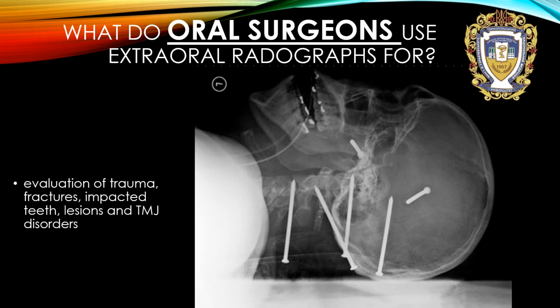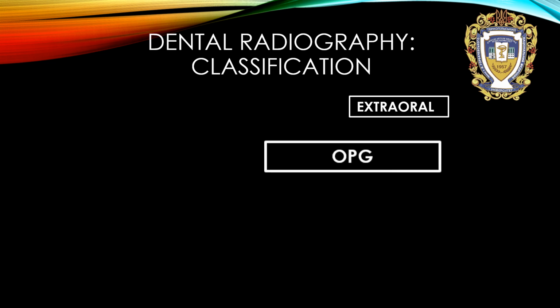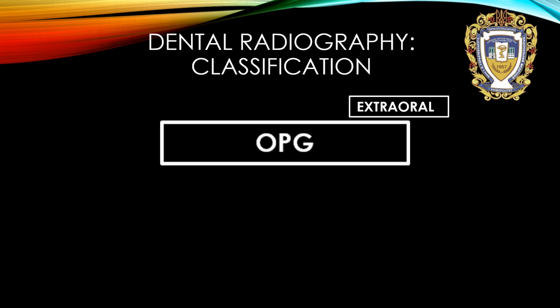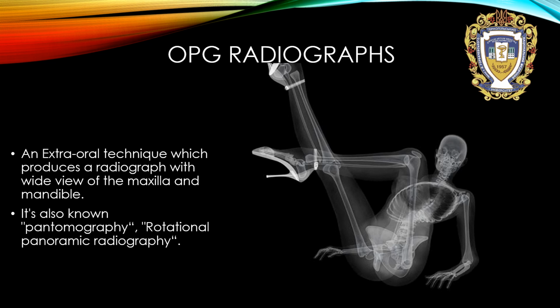What do oral surgeons use extraoral radiographs for? Oral surgeons use extraoral radiographs to evaluate trauma, fractures, impacted teeth, lesions, and temporomandibular joint disorders. And now, in detail, about orthopantomography, OPG radiographs.